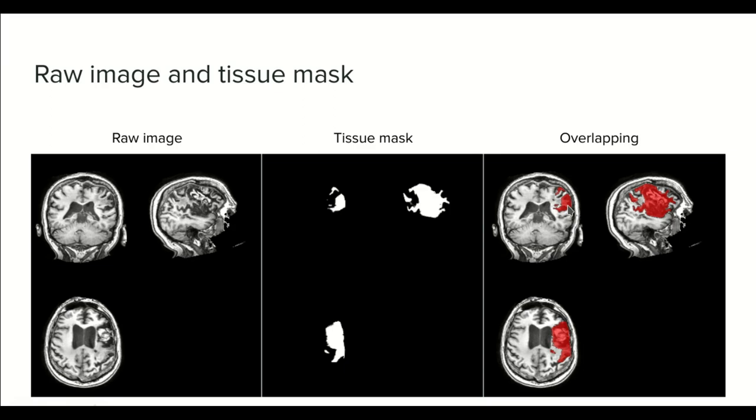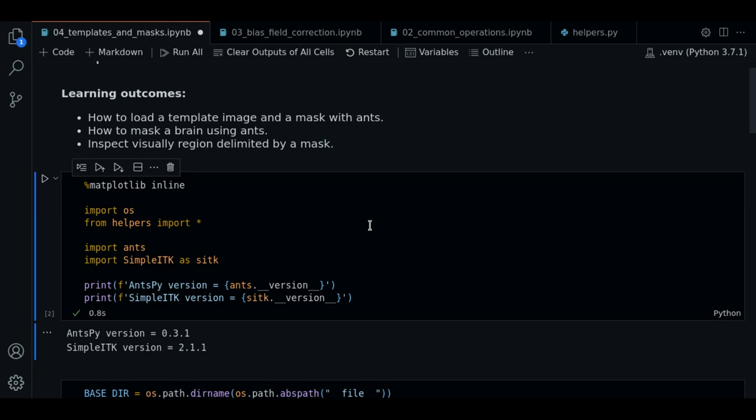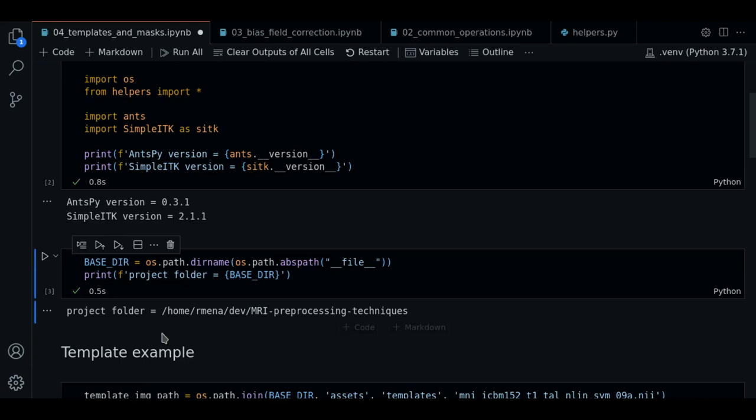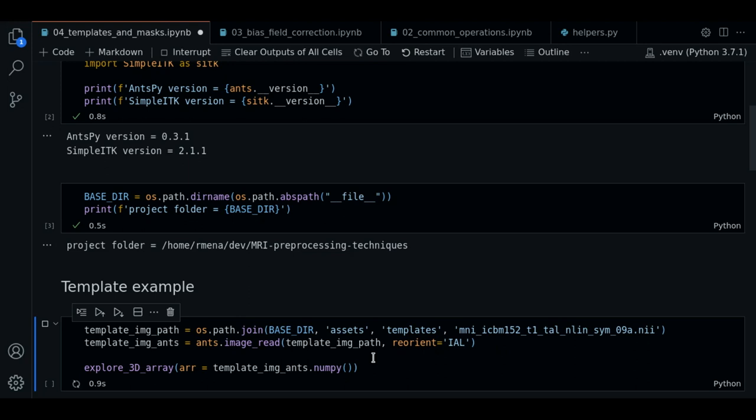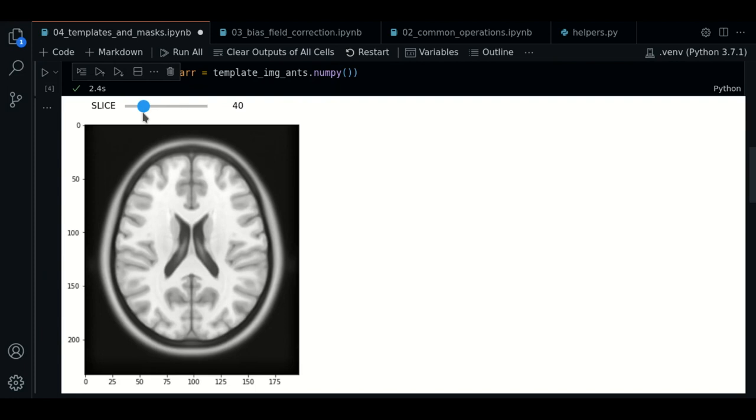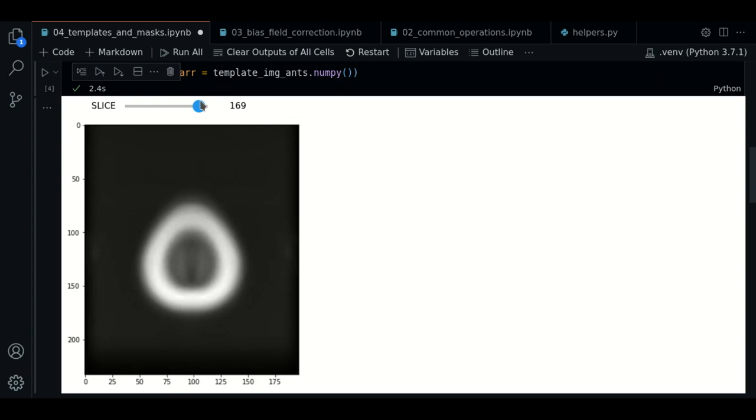So let's see in the code how this looks like. We start by loading our dependencies as usual, defining our basedir variable. We load our template image, but now this is located in the assets.templates folder. We load it with ANTSPY. We do the reorientation, and let's see the image. So this is how it looks like. As you can see, it is a well-shaped array, and the intensity values look okay too. This is what we call a standard.